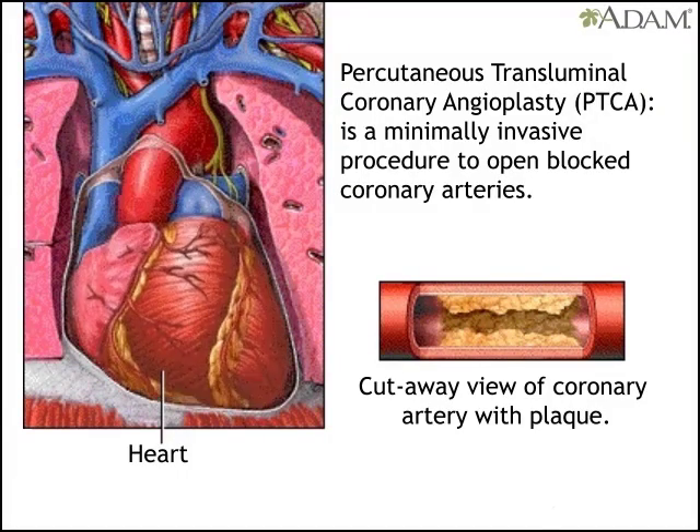PTCA, or percutaneous transluminal coronary angioplasty, is a minimally invasive procedure that opens blocked coronary arteries to improve blood flow to the heart muscle.